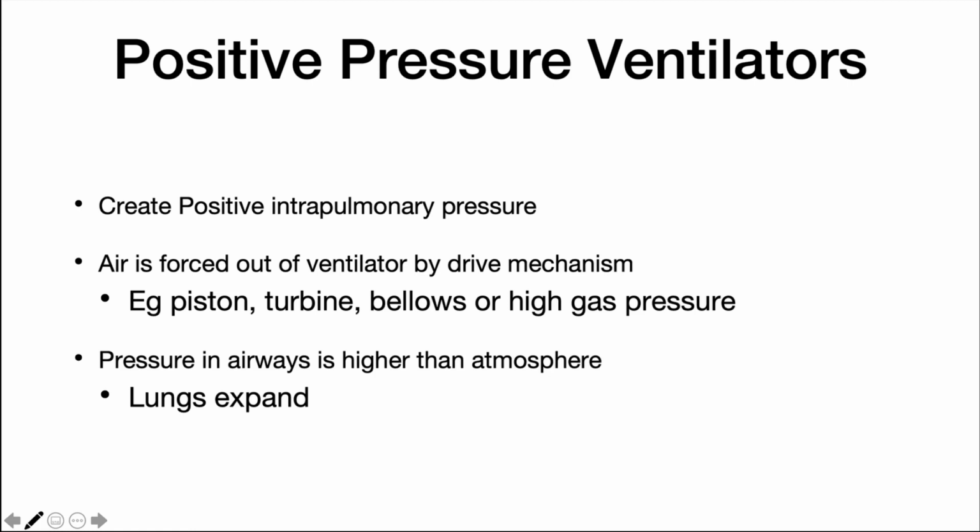In the late 1960s, ventilators began to be manufactured that incorporated analog and electronic technology to refine their control elements. These devices comprised the second generation of ventilators. And then the third generation of ventilators appeared on the market in the early 1980s with the advent of the microprocessor. With the incorporation of microprocessor technology, ventilators can now offer even greater control over their delivery systems, they were safer to use, and they consume less power. Today's ICU ventilators have a multitude of settings and variables.